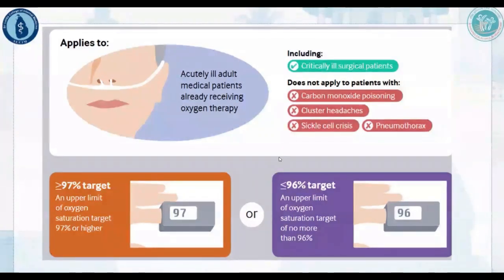Critically ill, saturation less than 85: you put the patient on a reservoir mask with 15 liters and proceed from there onward. However, if the saturation is a bit more than 85, you go ahead with nasal prongs first, assess in 2 to 3 minutes' time, put back the face mask and escalate up that ladder.